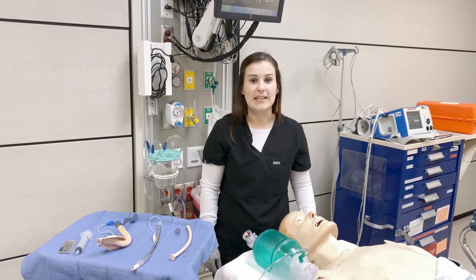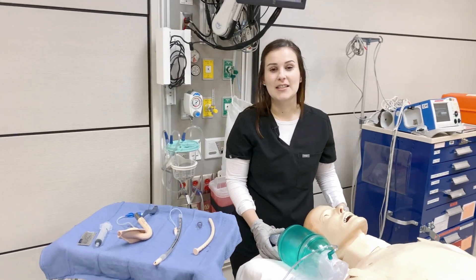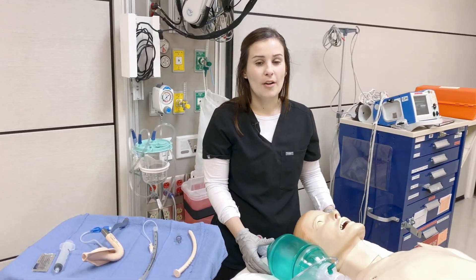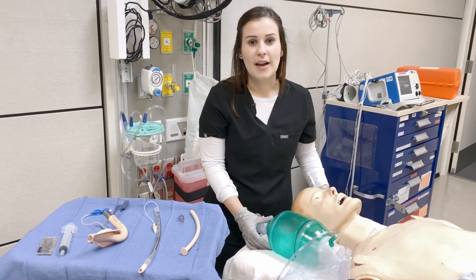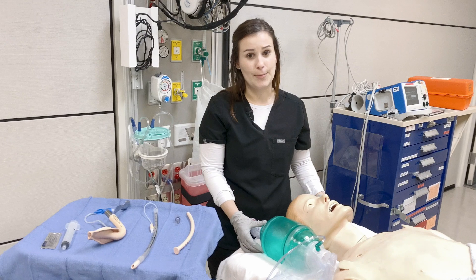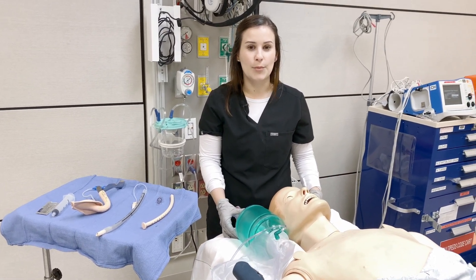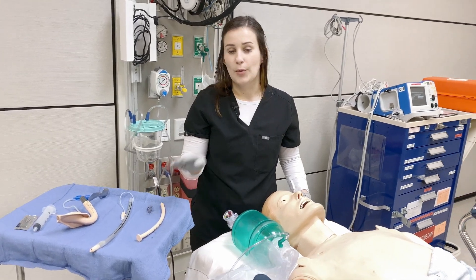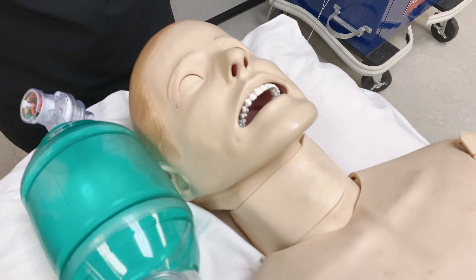Today I'm going to demonstrate using the intubating LMA. You may have come across an LMA during your anesthesia rotation in medical school or maybe a ride along during your EMS shift, but it's not often that residents have the opportunity to use the intubating LMA in the department. It's an important technique to have for that difficult airway, so today we're going to go over the equipment required and the steps used for the intubating LMA.